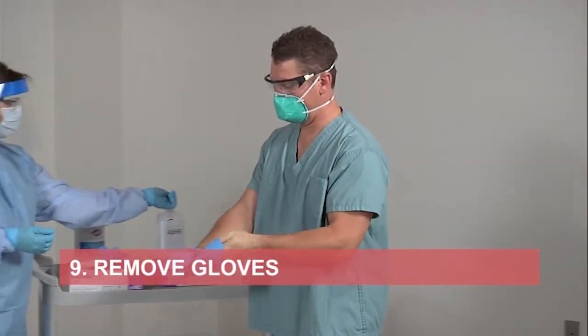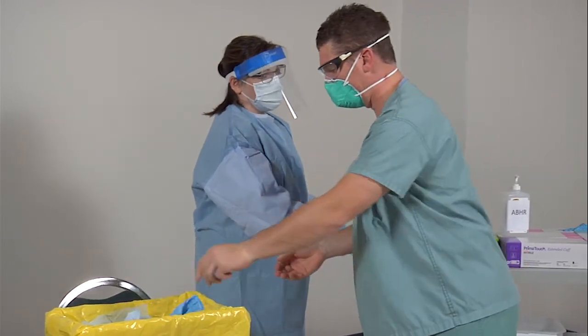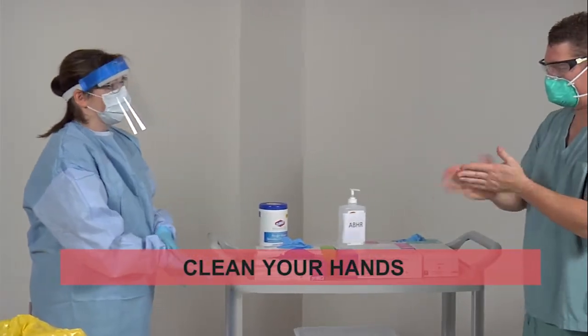Remove your gloves. Clean your hands with an alcohol-based hand rub.